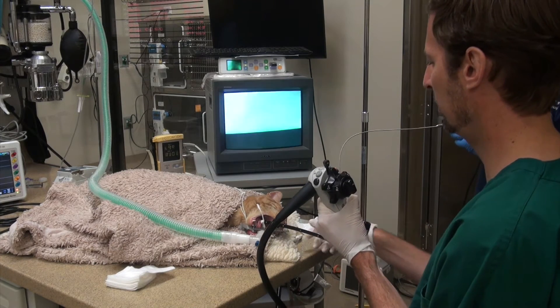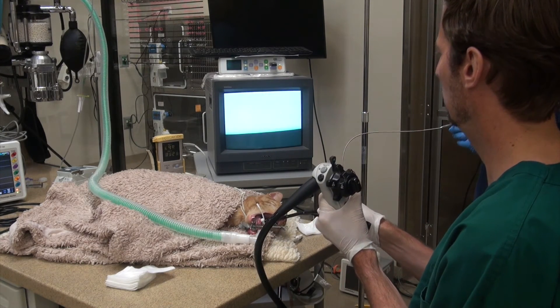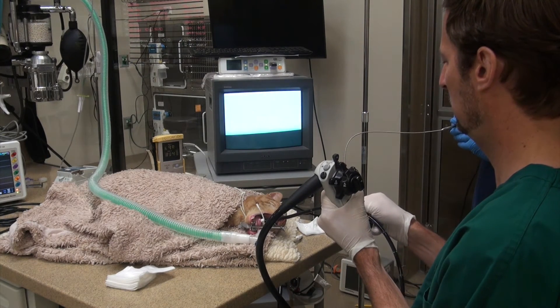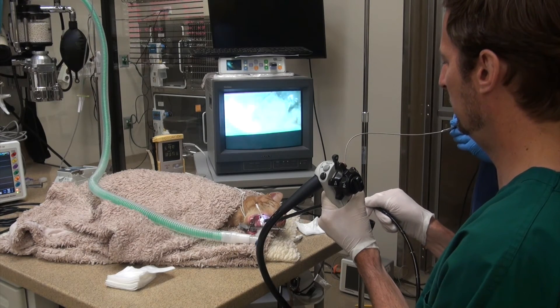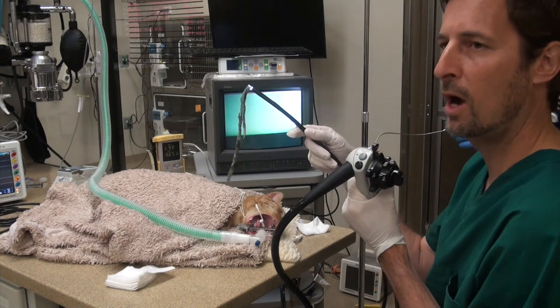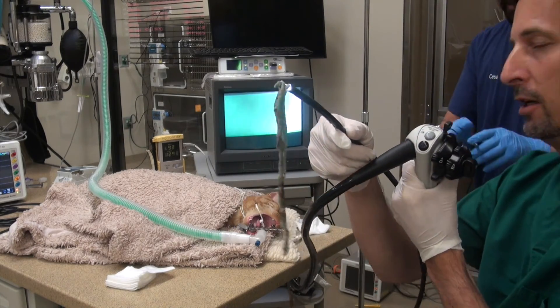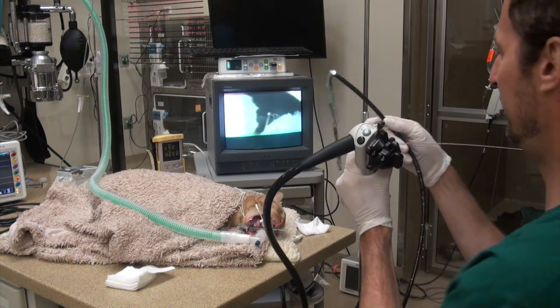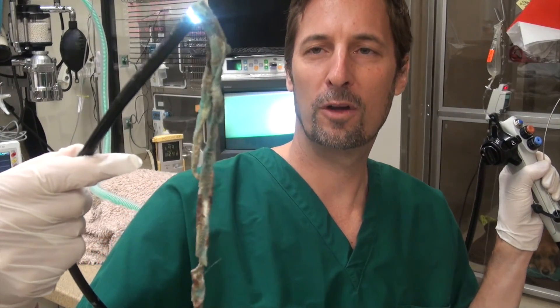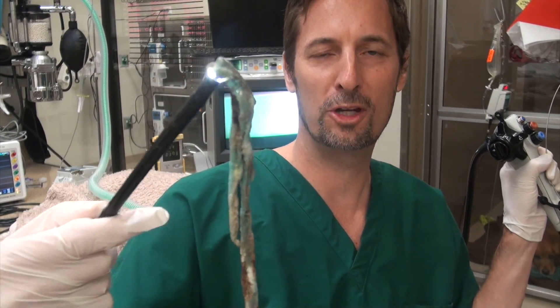I'm trying to hold the graspers too. Wow, here it is guys. Let me give them a close-up here. There it is guys — that's how we remove a gastric foreign body in a dog or a cat. Hope you enjoyed this video.